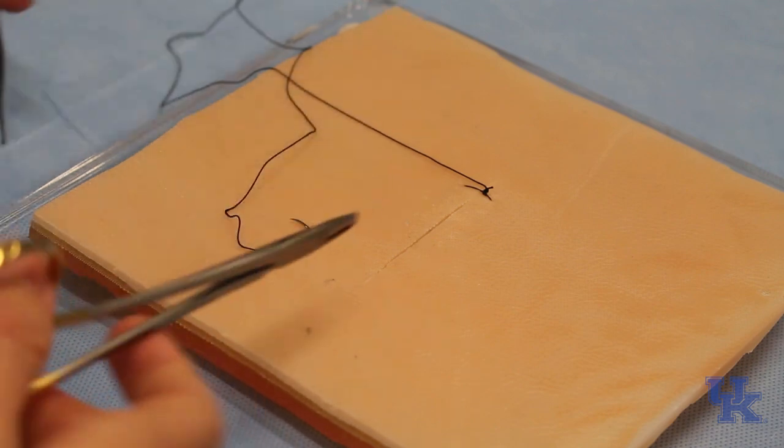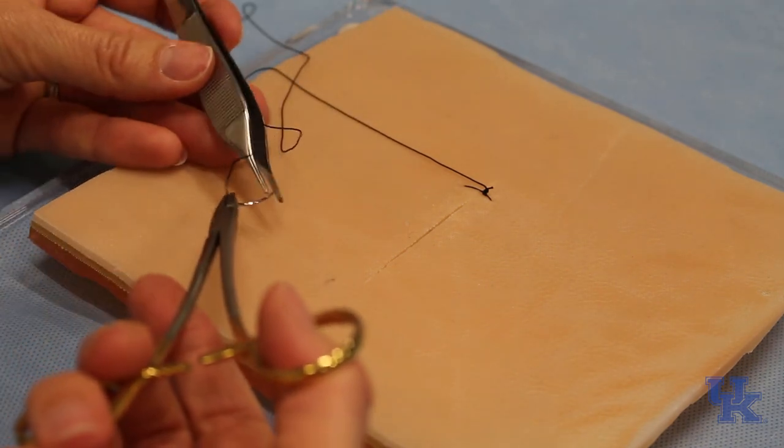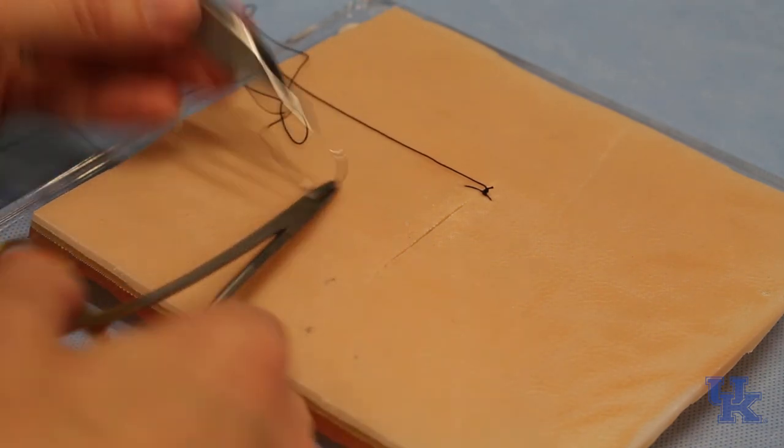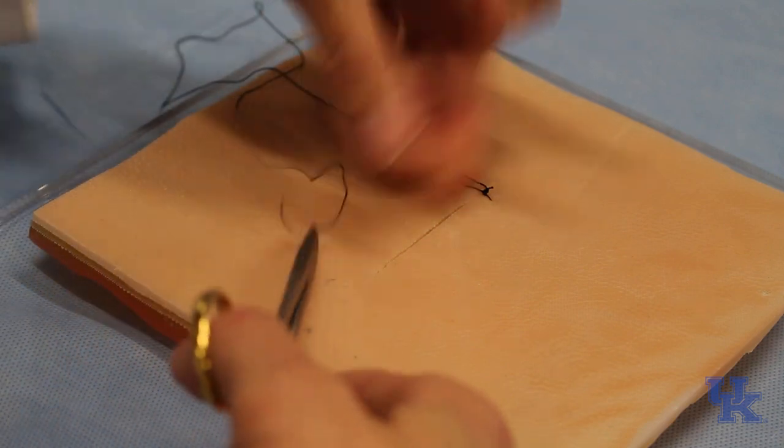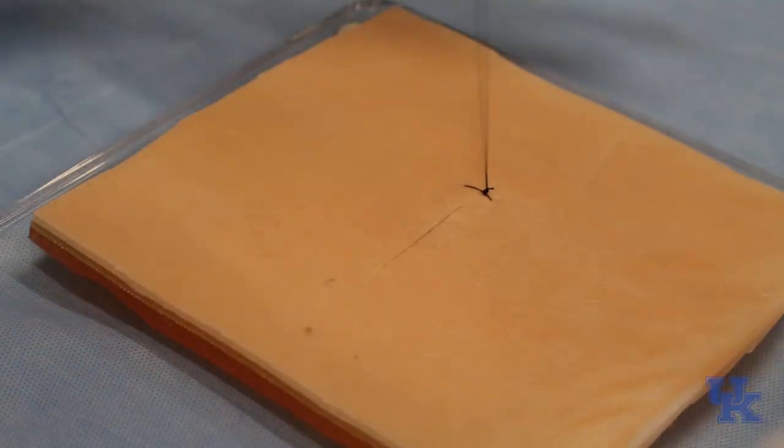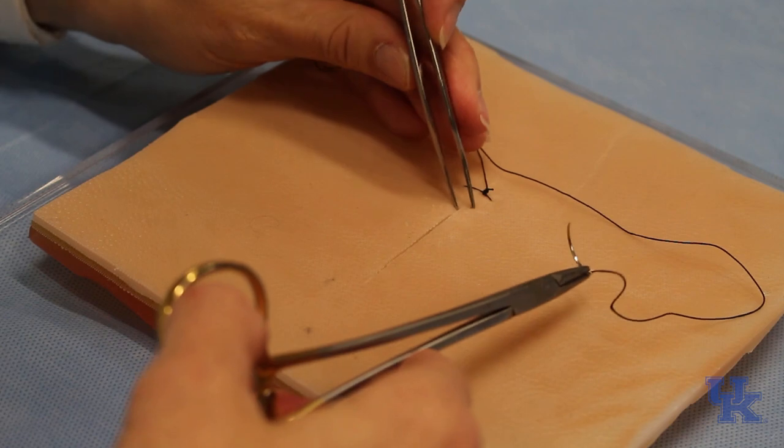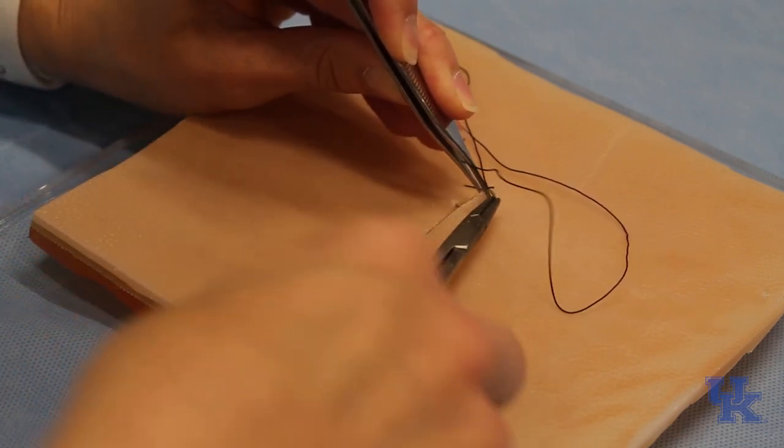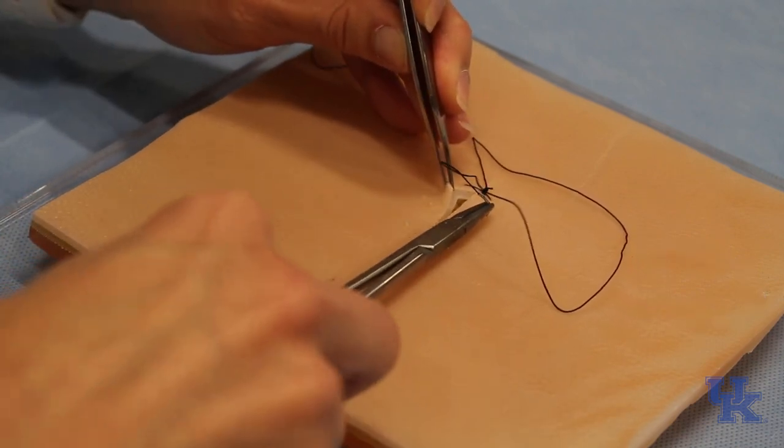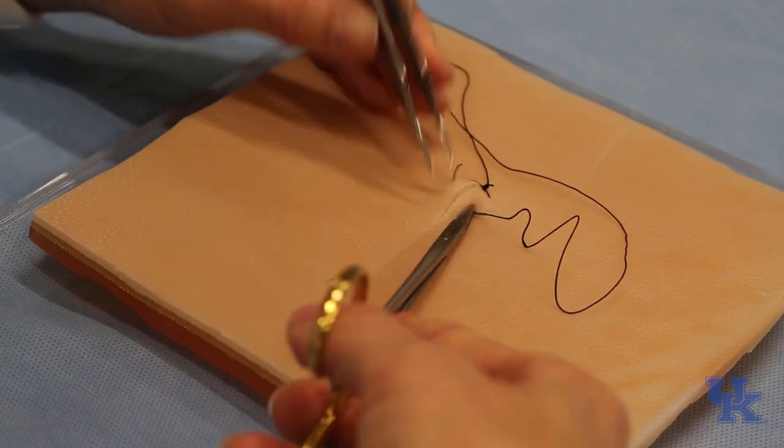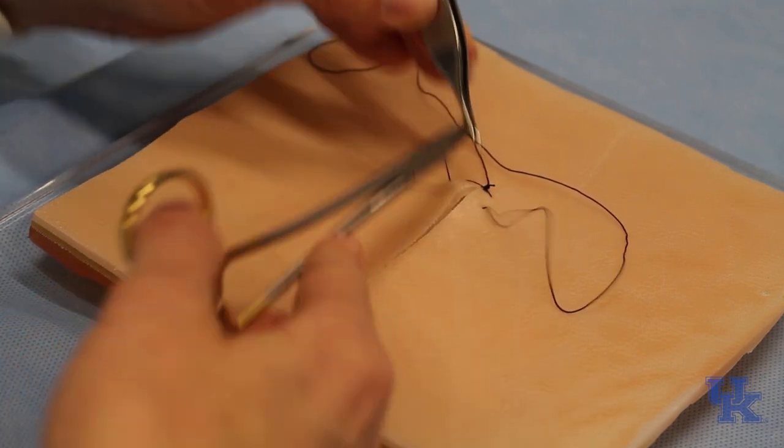And then we will use this end to run. You're going to pick up on this at 90 degrees, rotate, and for this we're not going to pull it out because I can see. Rotate through.